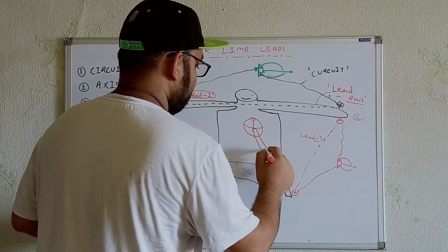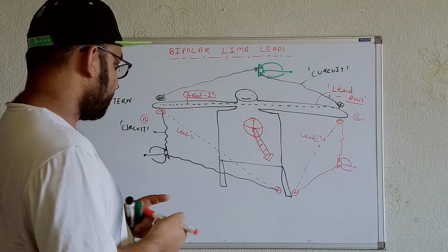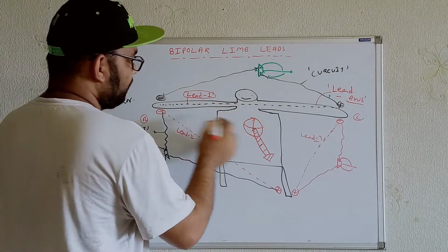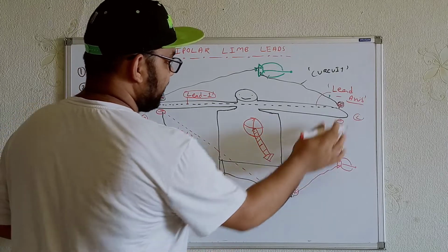The major ventricular depolarization vector is going downward and leftward in this way. Just try to understand from here that this is the positive side, and this is the negative one over here. In the same way, this is positive and this is the negative one.